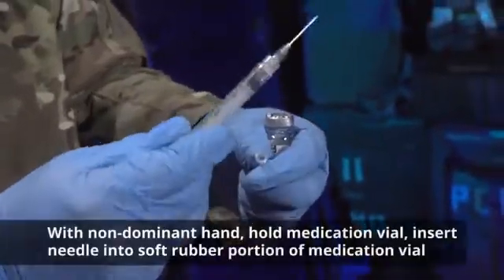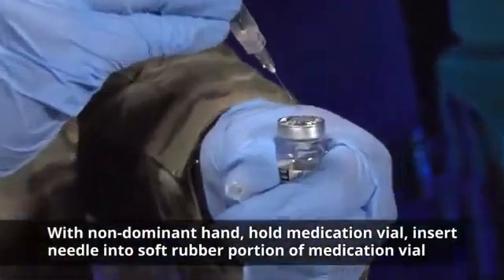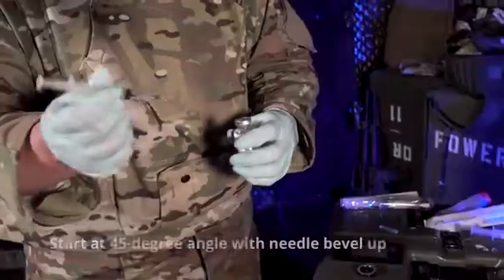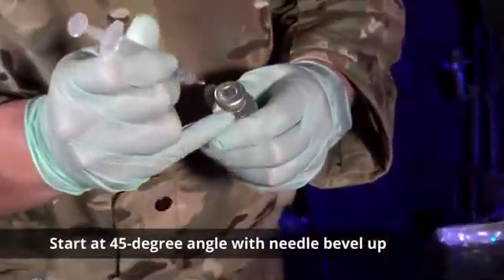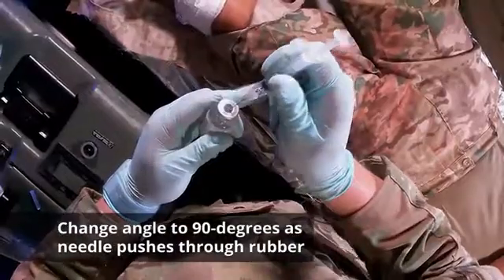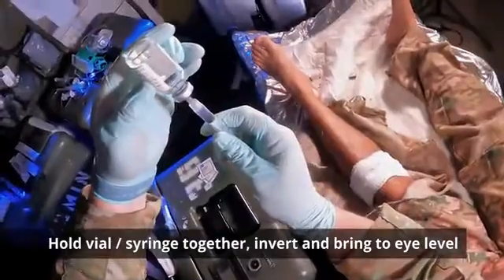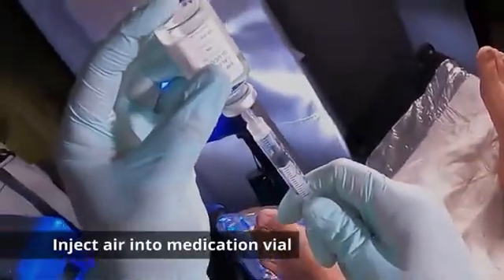With your non-dominant hand, hold the medication vial and insert the needle into the soft rubber portion of the medication vial. Start at a 45-degree angle with the needle bevel up. Change the angle to a 90-degree angle as the needle pushes through the rubber. While holding the vial and the syringe together, invert them and bring them to eye level. Take special care not to contaminate the syringe tip and the needle. Inject the air into the medication vial.